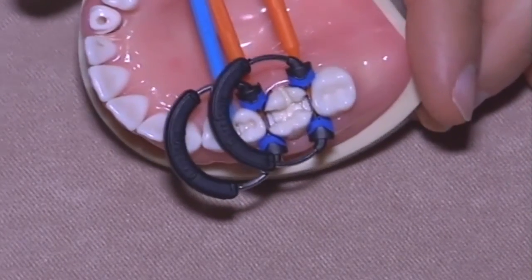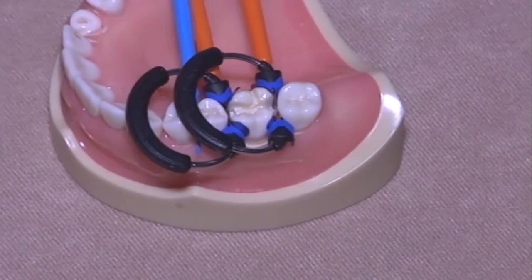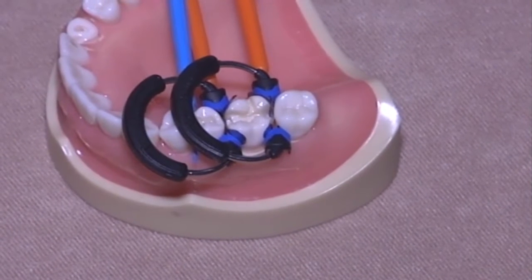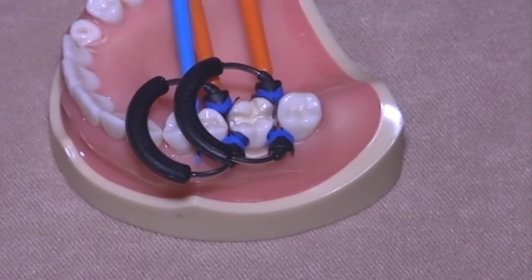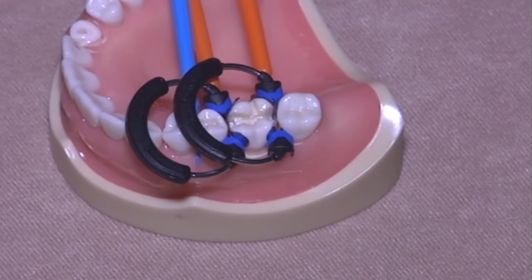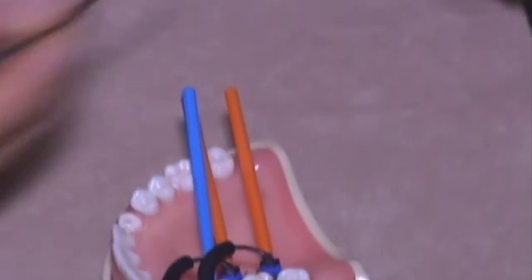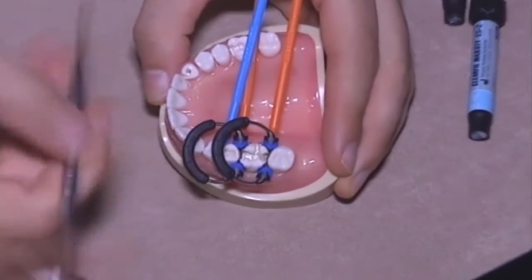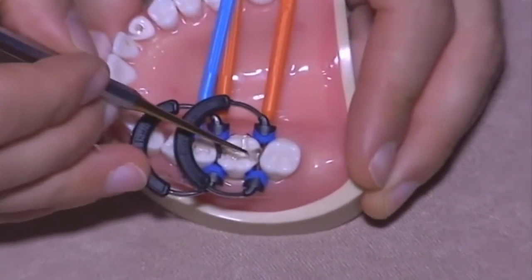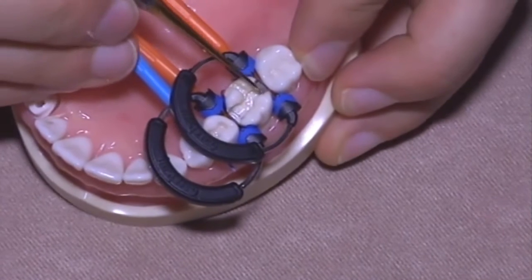Okay. In this case, you can even apply both this one and this one. You can even apply both the rings, and you see that you can easily go inside the cavity to build up the interproximal wall. The procedure is exactly the same, so I move faster than before.